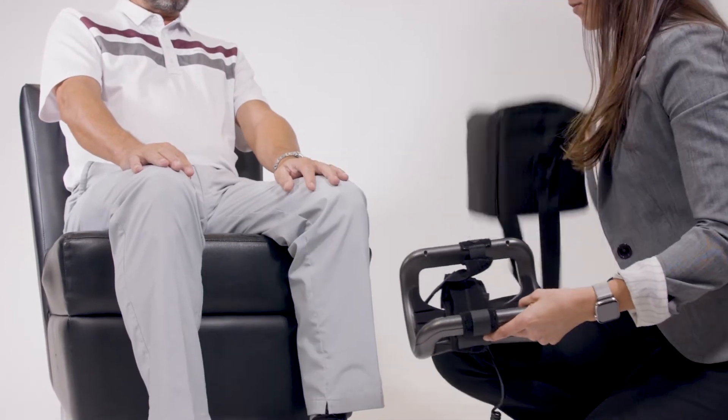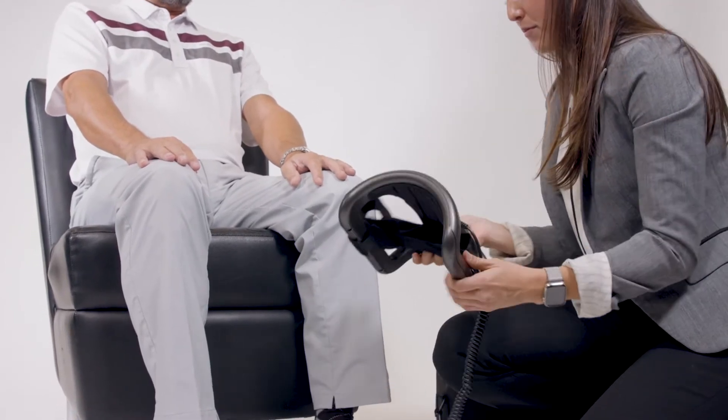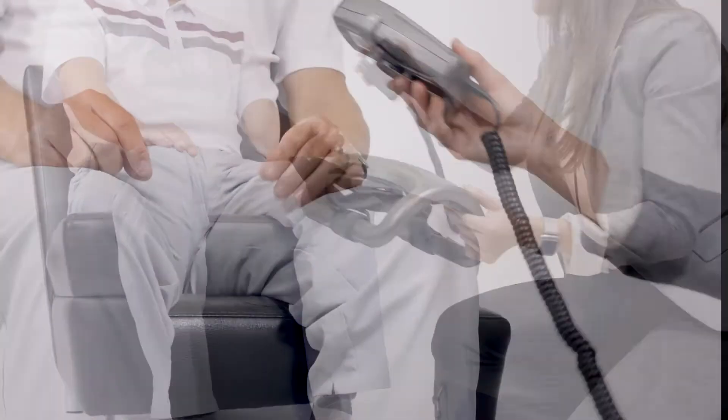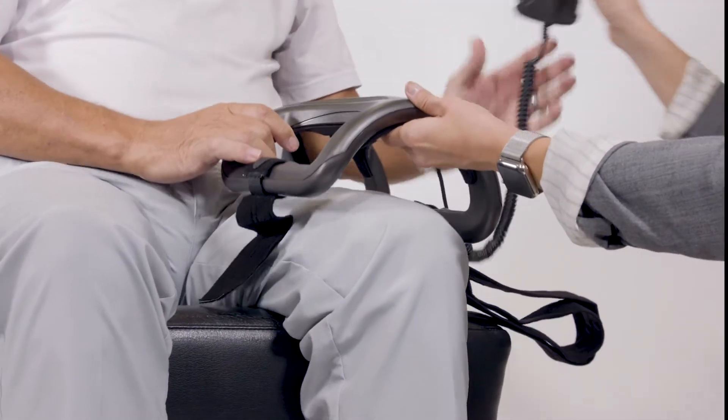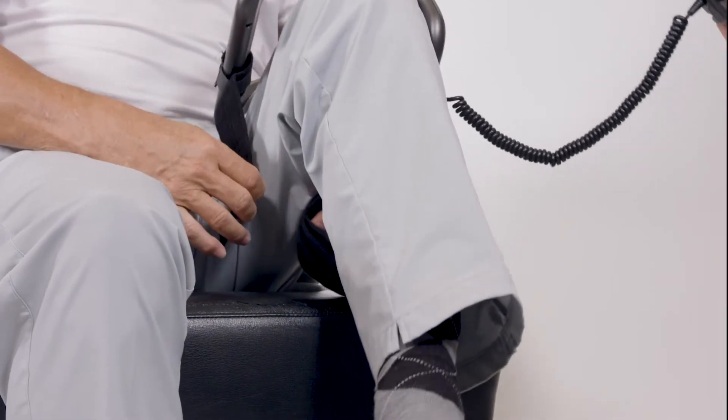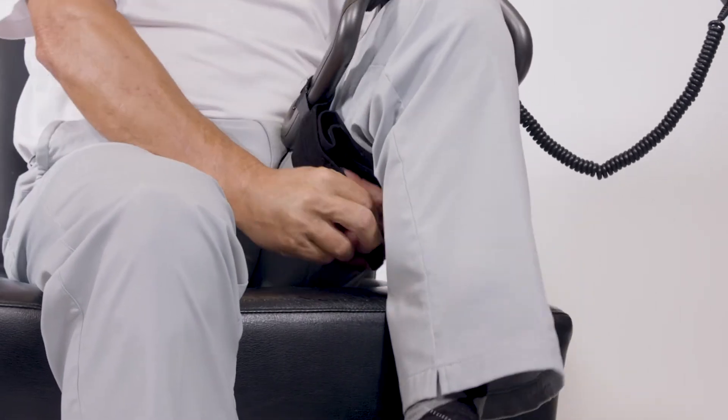The size 2 OL-1000 stimulator may be applied to a number of different fractures. The device also comes in two additional sizes that may be used depending on your fracture and its location. Your representative will choose the best device suited to your injury.